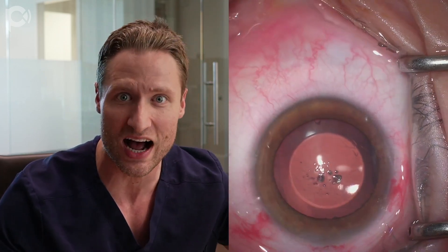Here I'm removing all of the cohesive viscoelastic from the eye using the IA handpiece. When that's done, I inject 0.05 cc of moxifloxacin into the anterior chamber — that's half the volume I use for cataract surgery, because there's a smaller volume inside the eye without removing the natural lens. I use a reduced dose because sterile endophthalmitis has been reported with moxifloxacin in ICL cases and the company advises against it, but I feel the risk of endophthalmitis favors an antibiotic injection at this smaller volume.